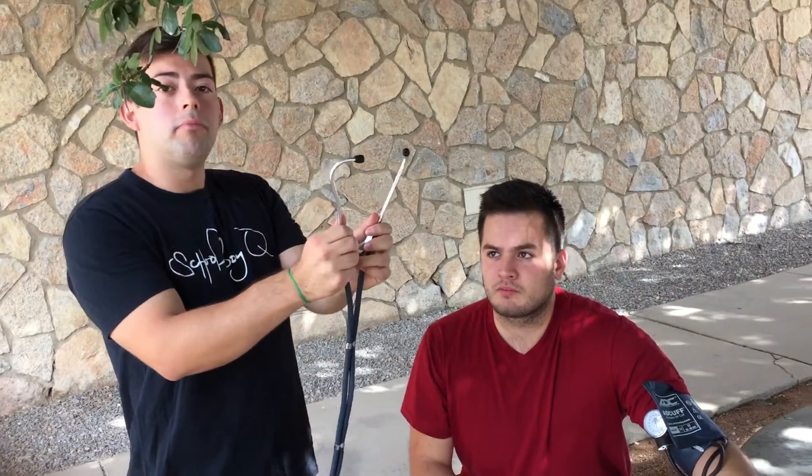The first sound is what we're going to call the Korotkoff sound — that's going to be your systolic. The second Korotkoff sound is going to be your diastolic. Now with your stethoscope, you're going to have these right here and you're going to want to be pointing them outward.